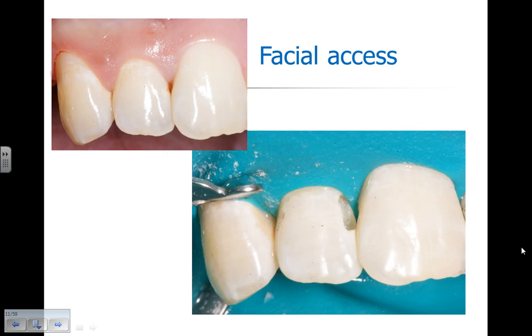Our completed preparation extends to the gingival area, the apical area of the contact, removes the caries, and creates our outline form. And this outline form and caries removal was done using a 35 inverted cone burr, initial penetration with a high speed with water spray. Final preparation or removal of caries was done with the 35 inverted cone using the electric handpiece running on slow speed at a torque of 75.